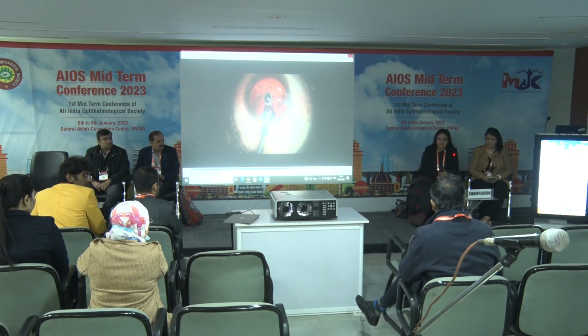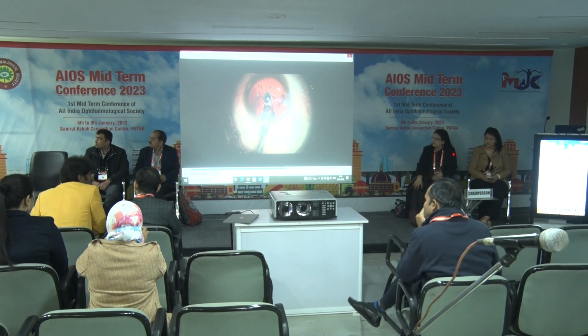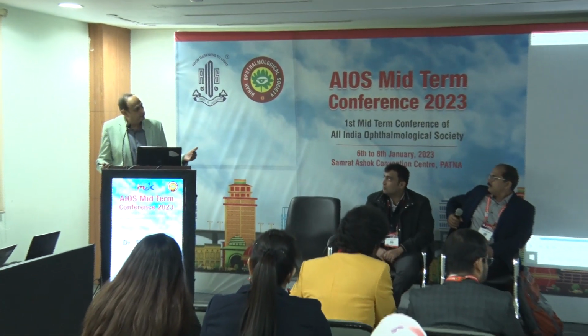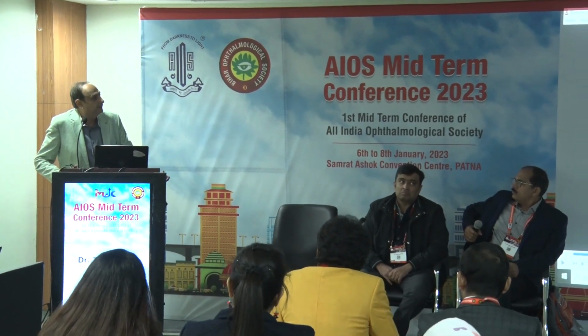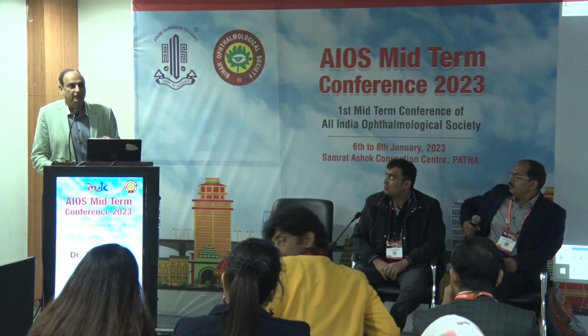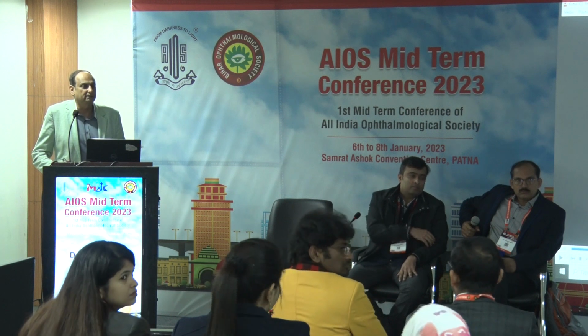So one of the lessons which we learned after this particular patient was, the patient was 120 kgs, she had a short neck, all that stuff, and probably our viscoelastic cleaning was not good. So now what we have started doing is, whenever we are in doubt, we first of all give a mannitol and then let the patient go. Then this has never happened. So that was one tip which I got.